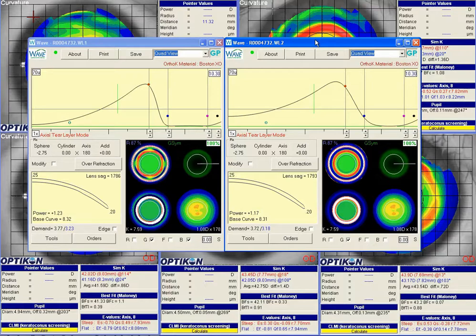The big change I would recommend making to this lens is going with a larger OAD. With the baseline topography, I'm measuring at about 11.3 HVID, and I measure HVID very generously. I can probably even kind of manipulate that to even larger.